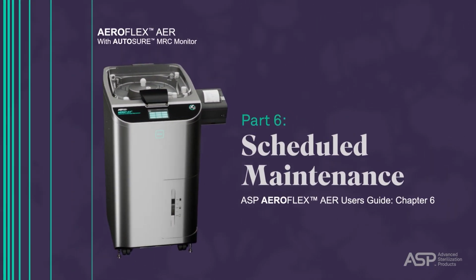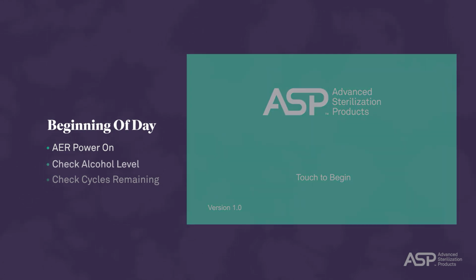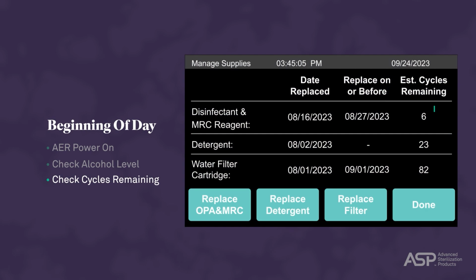At the beginning of each day, confirm the ASP AEROFLEX AER power is on to allow ASP Aero OPA solution to warm up. Next, check alcohol level and refill if necessary. Note that you may also need to add during the day depending on usage. Finally, check the cycles remaining in the Manage Supply screen for disinfectant, detergent, and water filter, and replace solutions as indicated.